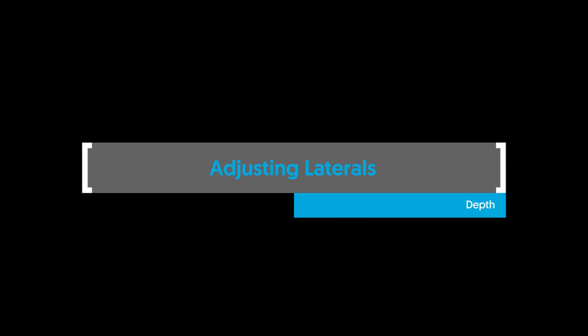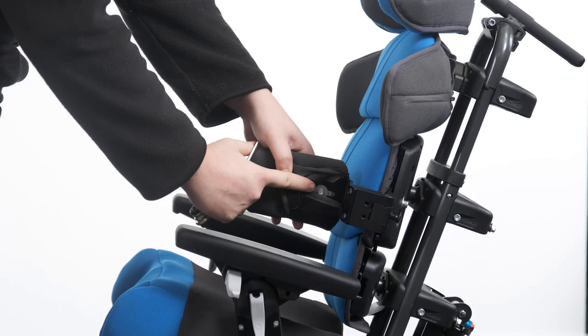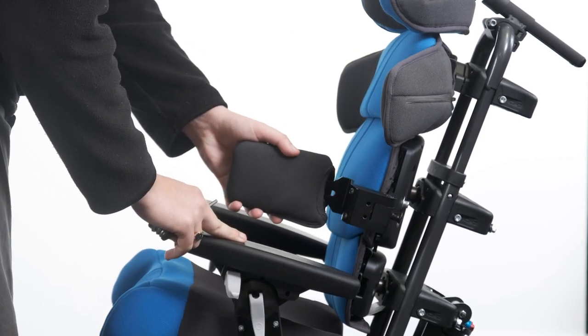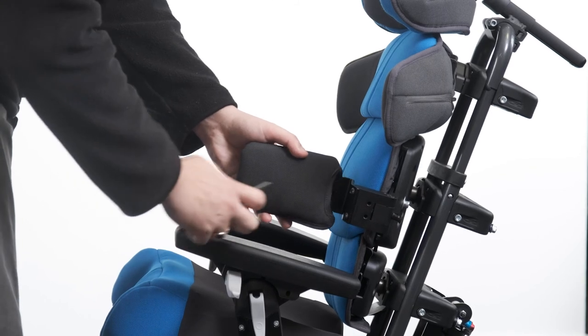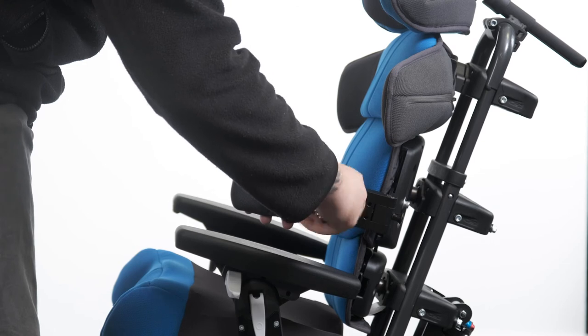Adjusting laterals — depth. To adjust the lateral depth, open the velcro of the cover to gain access to the adjustment bolt. Loosen the bolt and adjust forward or backward to the desired position. Tighten the bolt to secure in place. Reattach the velcro cover.